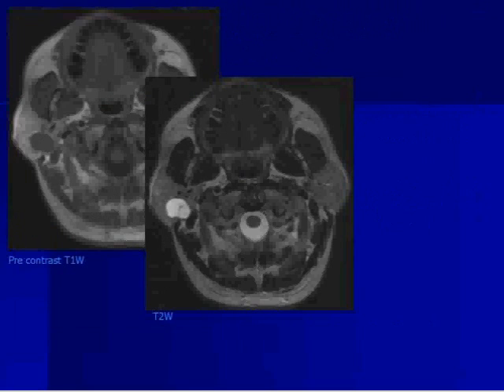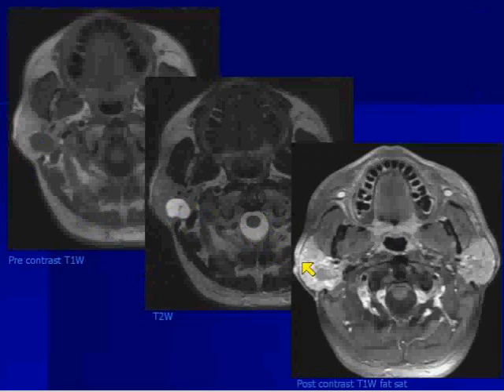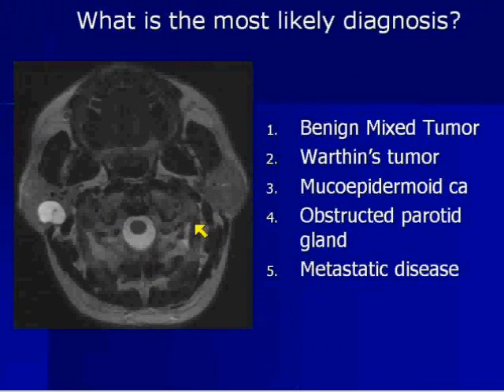We already saw the tumor in pre-contrast T1 — looks pretty well-defined. Look at this lesion now in the parotid gland. It is so bright — bright like a light bulb. Look at how it matches the signal intensity of CSF. This is very important. And then it enhances — it could enhance variably — but the whole point here is the T2-weighted sequence.